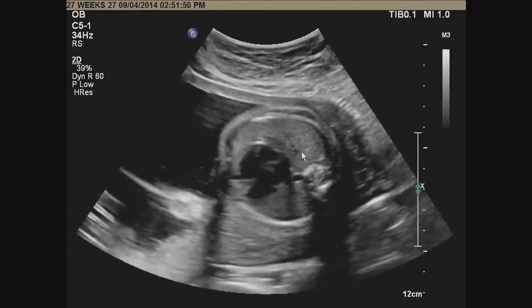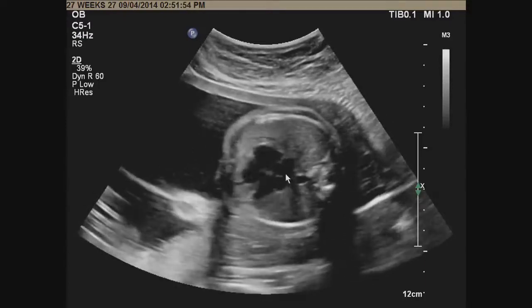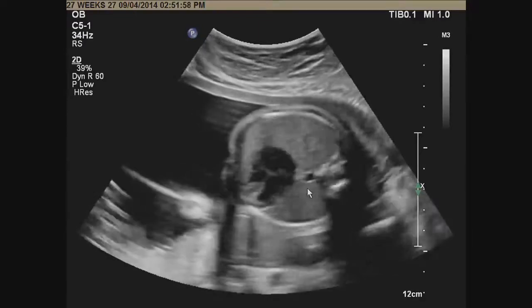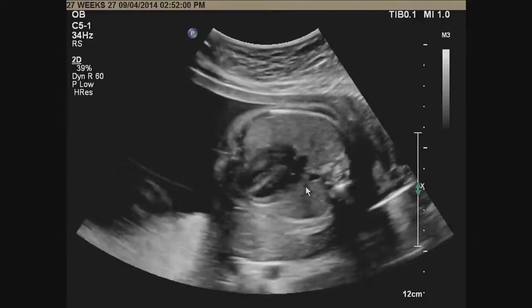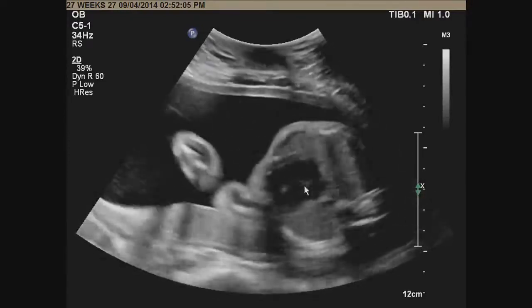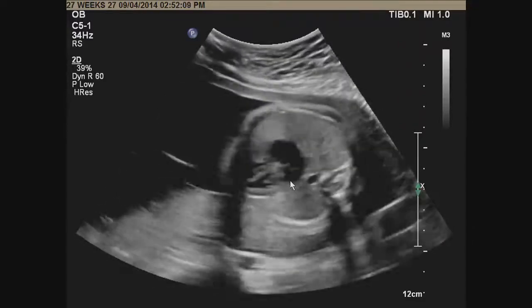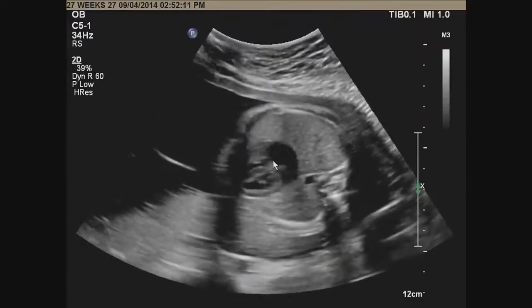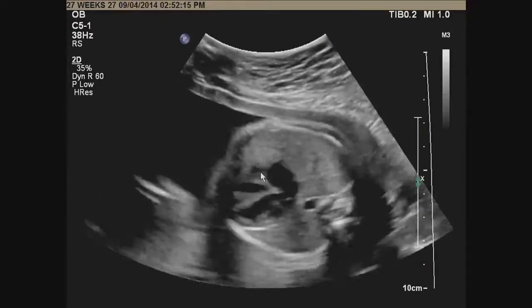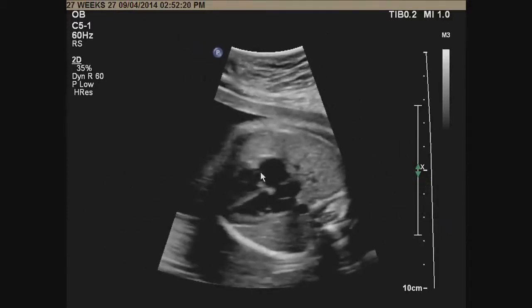It's good to look at the pulmonary veins, so you can see them here even on grayscale. This is the left atrium, right atrium, left ventricle, right ventricle, descending aorta, right? So that's the first orientation. Now I'm going to slide my transducer on the abdomen and come back into an acoustic window that gives me almost a transverse view. So here I'm going to reduce the depth. Now I'm going to narrow the sector width, now that I've found a nice acoustic window to get in.